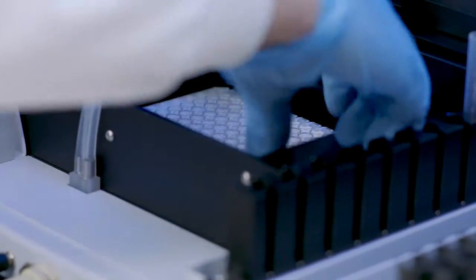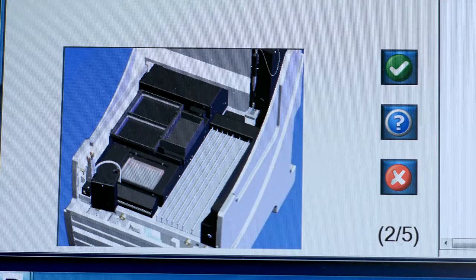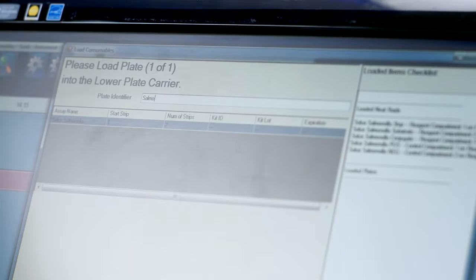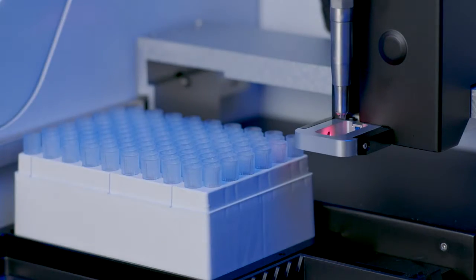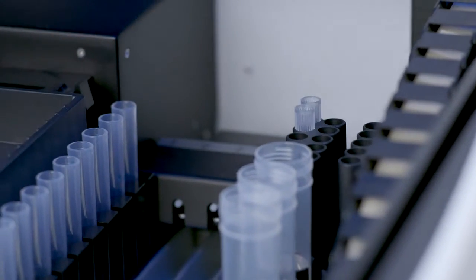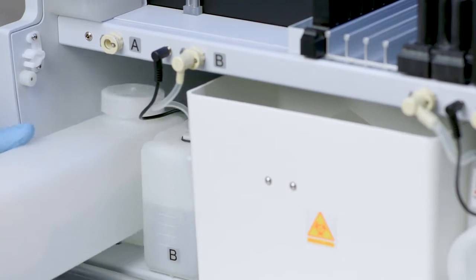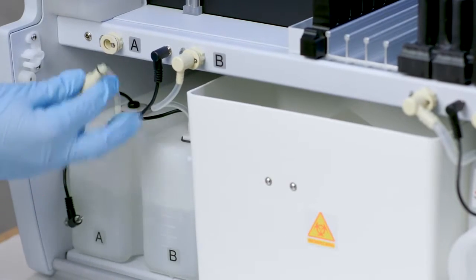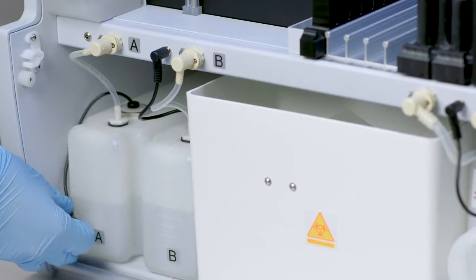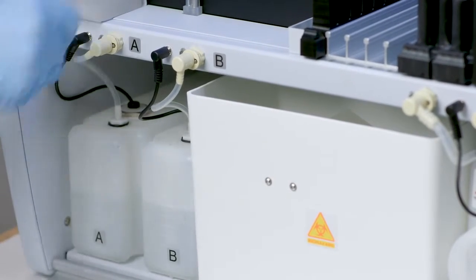The test plate, pre-coated with antibodies, is loaded into the Solus DS2. Identifier codes for the test are input into the software and the sample tip rack is loaded, followed by the Solus reagent tips. The software will request that the operator checks the Solus washing buffer and deionized water levels. Empty waste tanks if necessary.